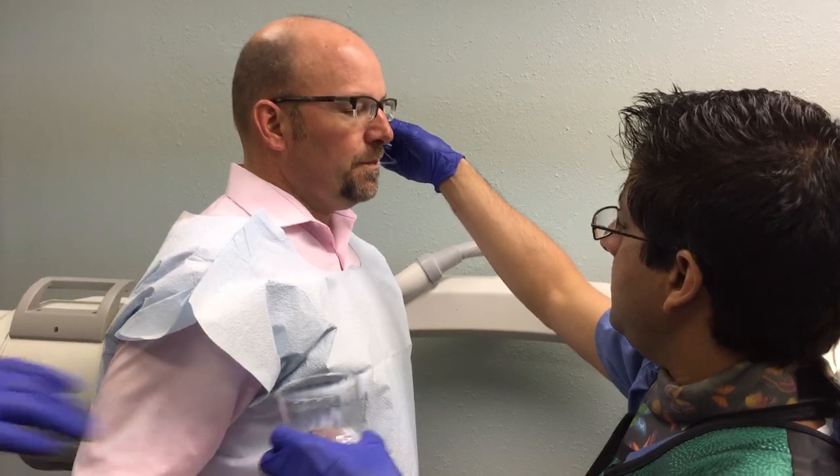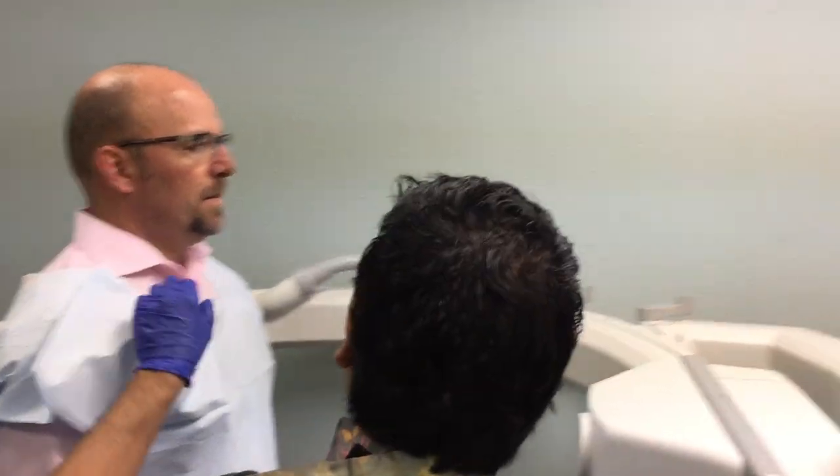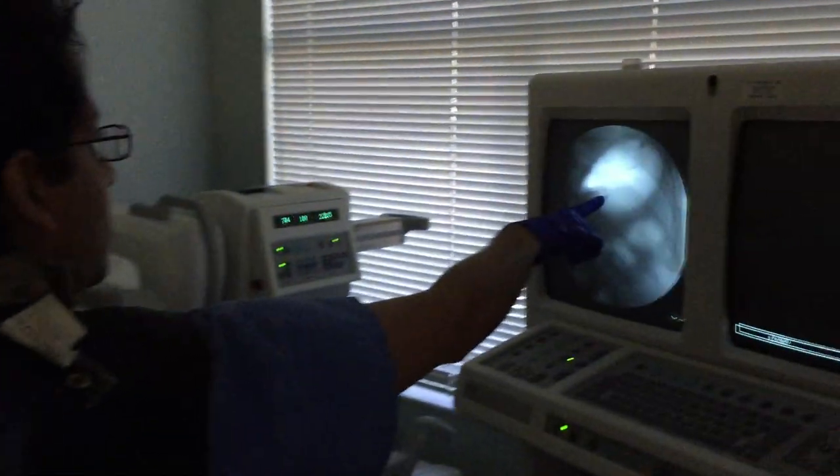Can I have some more water? Go ahead and finish that off. Take your time, if you need a break then take a break. Okay, last one. I'm just going to keep this here, right there. Hey, x-rays going on guys. There's that — there's the other balloon.